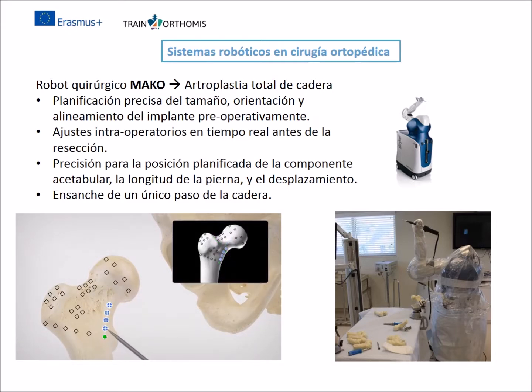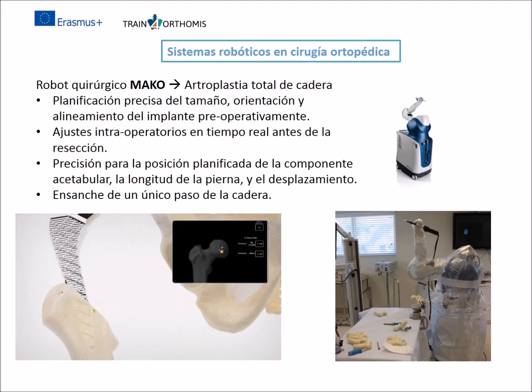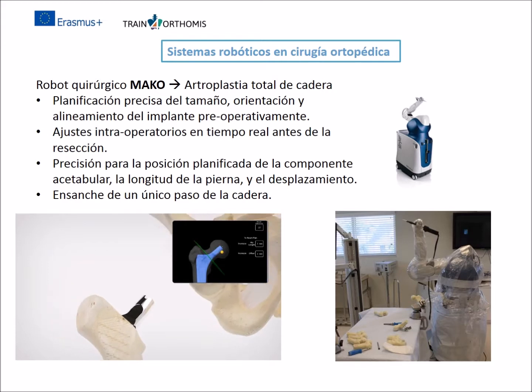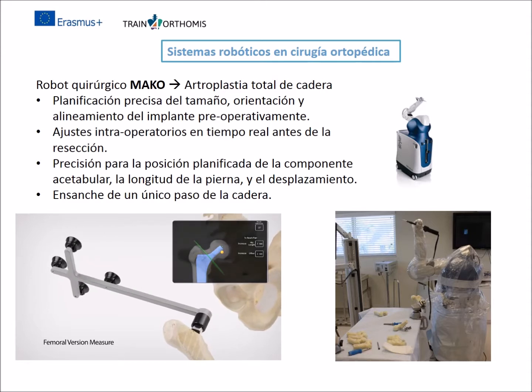During surgery, the patient's unique hip joint is registered and aligned to the preoperative plan. The surgeon plans and accurately defines the level of the femoral neck resection in order to achieve ideal leg length restoration. Once the head of the femur has been removed, the femoral canal is prepared using broaching instruments. The broach tracker is applied on the taper of the trial femoral stem, and femoral version is measured.